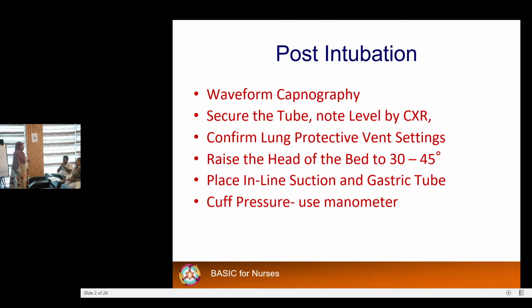Suction, ambu bag, in case of extubation you have to re-intubate your patient. What is this? What is this? For what? Regarding the ETT? Pressure of the cuff. Is it important to measure the pressure of the cuff? Why?